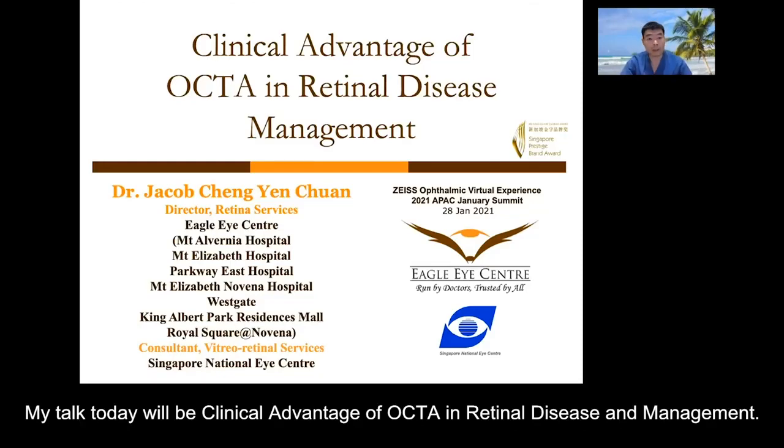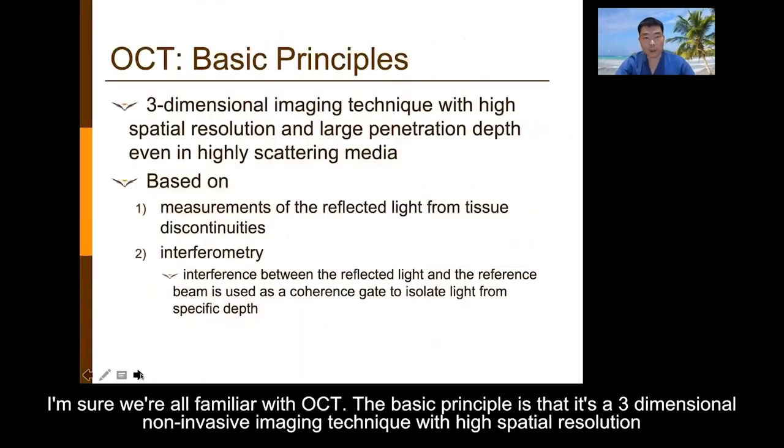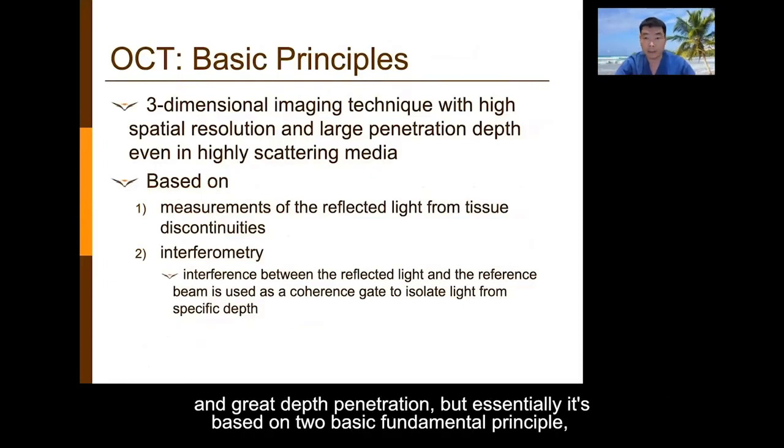My talk today will be clinical advantage of the OCTA in retinal disease management. I'm sure we're all familiar with OCT. The basic principle is that it's a three-dimensional non-invasive imaging technique with high spatial resolution and great depth penetration.